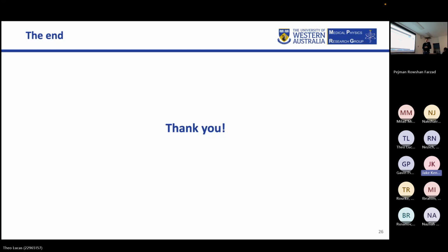Or just through the registration. I think that's really the main part. So every voxel comes with an uncertainty measure due to the registration, and any matching decision made in that voxel comes with that uncertainty. Yeah, I like that. Following on from that, do you think there are any particular causes of the poor registrations for the cases that did have poor registrations? Like was it patients in different arm positions or something? That was definitely one factor. Significant changes in especially anatomical position. I didn't analyze too closely the cases where the registration was poor.